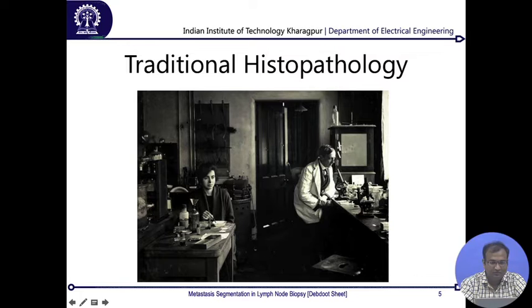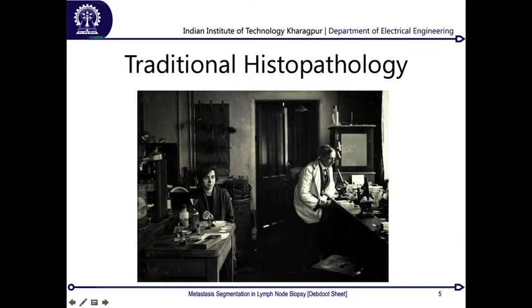The old technique was that a doctor pulls out the mass of tissue, and a technician prepares it into slides. As we learnt on the microscopy side, you have to do some sort of processing for that, and we also saw the histology slides for oral biopsies. Over here you will have a similar kind of slides prepared for lymph node biopsies.